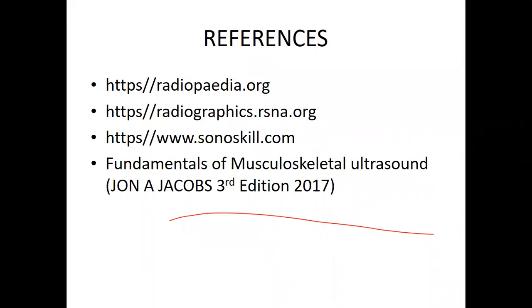Again, I'll respond to this in relation to how I presented it. Remember, a patient must constantly be making or implementing some maneuvers. So for example, if I want to appreciate the supraspinatus, it will be very difficult for me to tell the patient to demonstrate, because specific maneuvers will bring out specific structures. So you may find it a challenge unless there are some obvious things that can be picked, but minute or subtle abnormalities may not be picked when you just do the patient in a modified way.